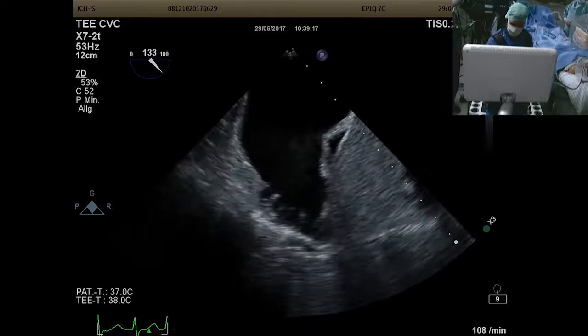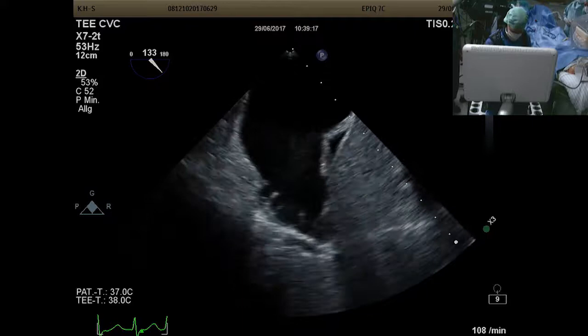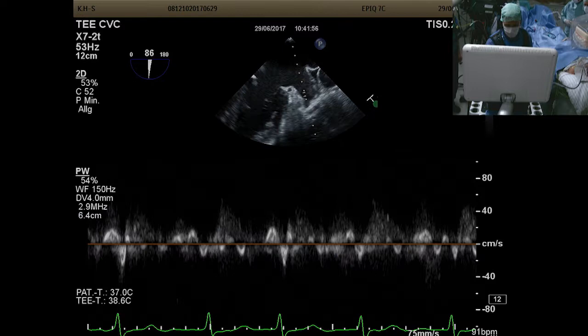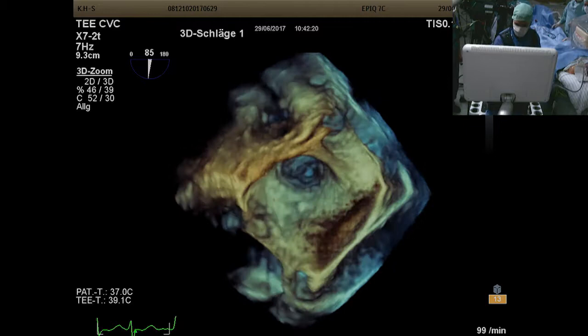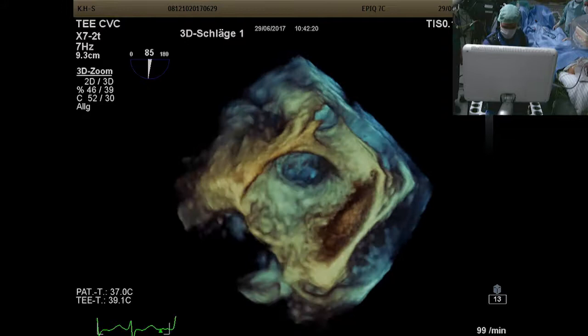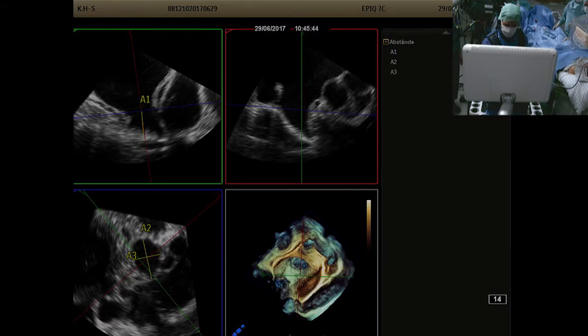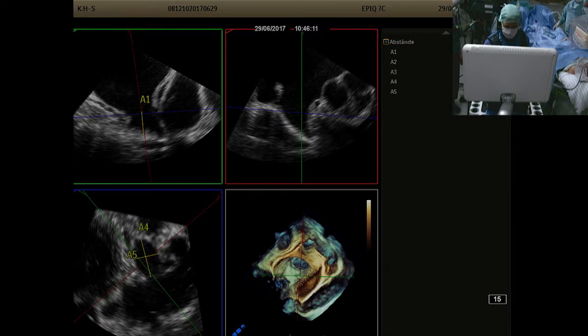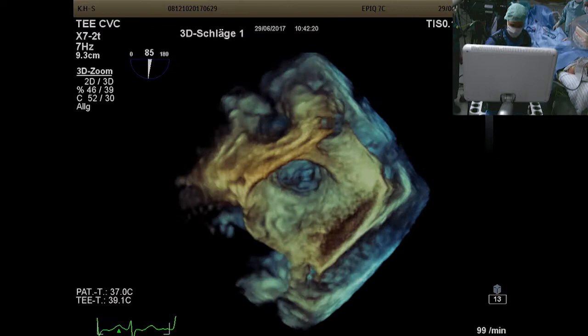At 135 degrees, we can see the trabeculae but no thrombus. The flow in the LAA is shown. 3D also helps, giving a good view of the LAA, showing the ostium is really oval-shaped. Using Q-Lab, measurements at the landing zone are around 29 to 30 mm — that's the maximum diameter for this LAA.